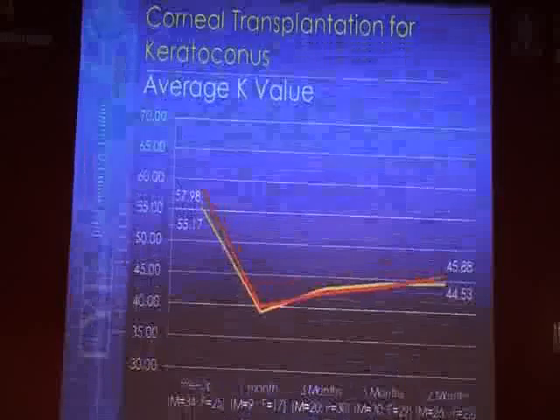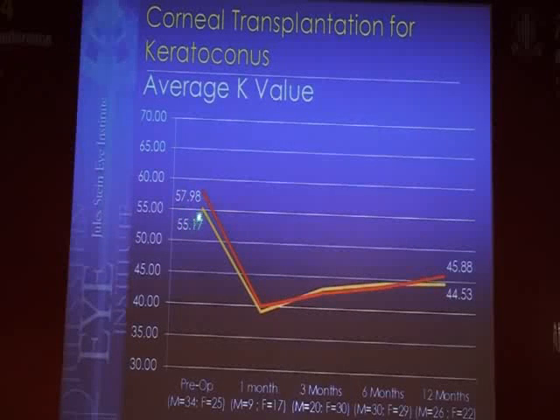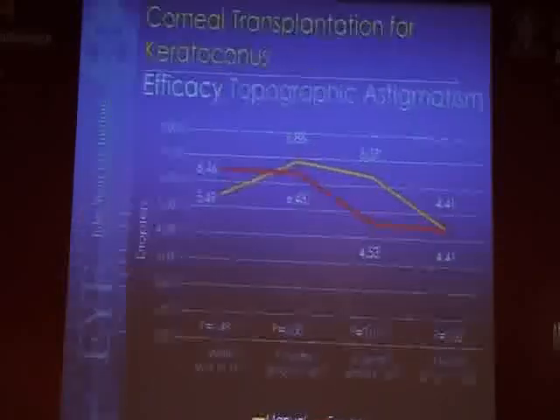And you'll see that preoperatively, the group who had the femtokeratoplasty was starting off about 2.6 diopters steeper, and postoperatively about 1.3, 1.4 diopters steeper. So there's a greater flattening effect when you use the femtosecond laser, in part because the donor is not oversized. Use the same size diameter for the donor trephination as you do the recipient trephination.